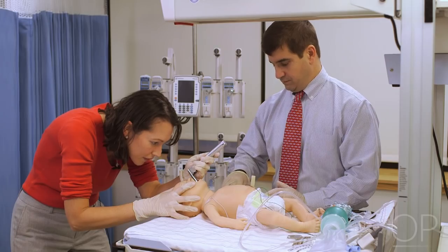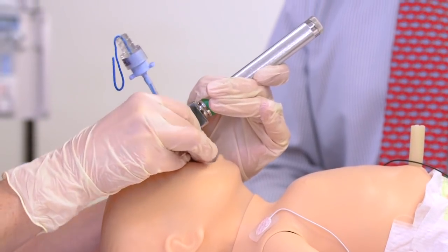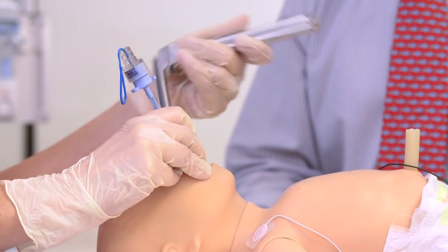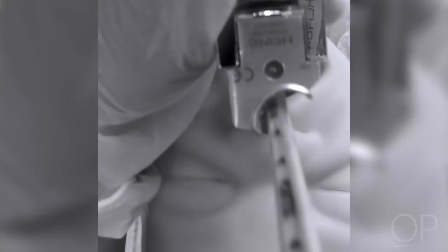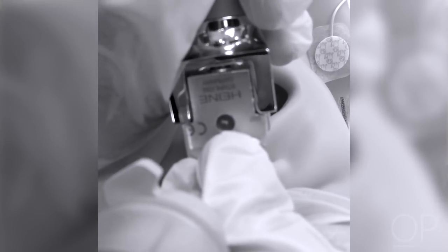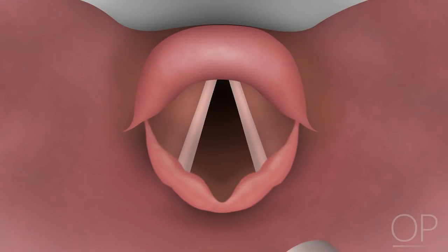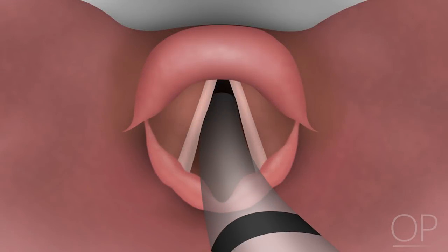Once the vocal cords and glottis are visualized, the provider performing the intubation should keep focus on the vocal cords. The endotracheal tube should be handed to the intubator by one of the other team members. The tube should be inserted from the right side of the mouth through the vocal cords using one smooth motion. Avoid insertion of the endotracheal tube into the barrel of the blade as this will block your line of sight. The tube should be advanced into the trachea to the appropriate depth; cognitive aids such as the table from the neonatal resuscitation program are available. Endotracheal tubes may have lines near the distal end to guide depth of insertion.